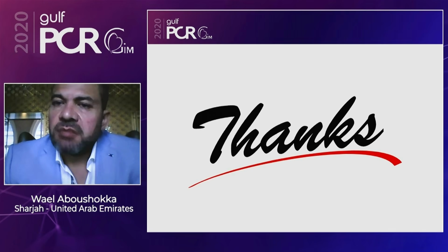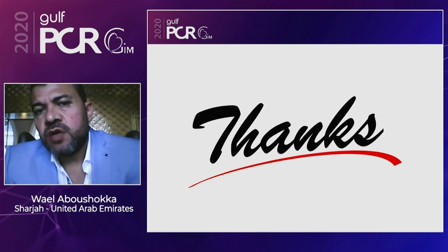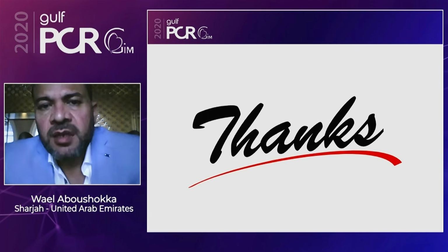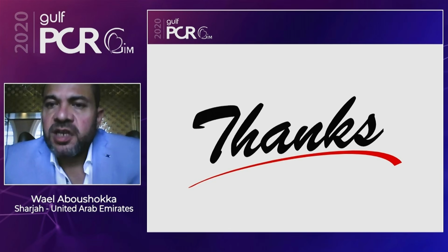And I wanted to mention also in my take-home message, using intravascular imaging is crucial in most of the calcific lesions to put a strategy for your case. Although I didn't use any intravascular imaging in this case because of reimbursement issues, usually I use it in more than 99% of my cases, not only the calcific, but all cases. And with the presence of a lot of equipment in management of calcific lesions, you need to choose the proper device for each case.